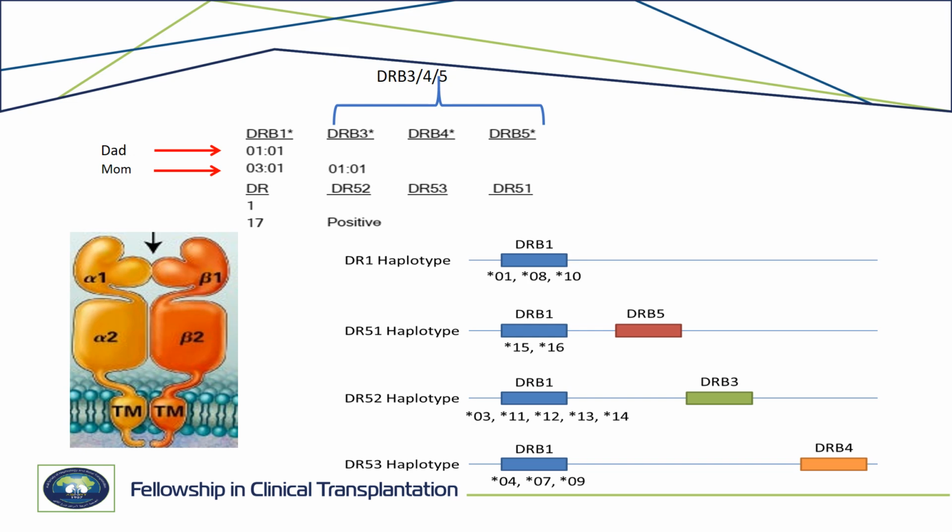And another reminder, we don't do HLA typing for the DR alpha, just the DR beta. If you look at the serological equivalent, you can see that DR beta 1*01 is equivalent to the DR1, but for the DR beta 1*0301, the serological equivalent is DR17. So it's not usually a straightforward serological equivalent.